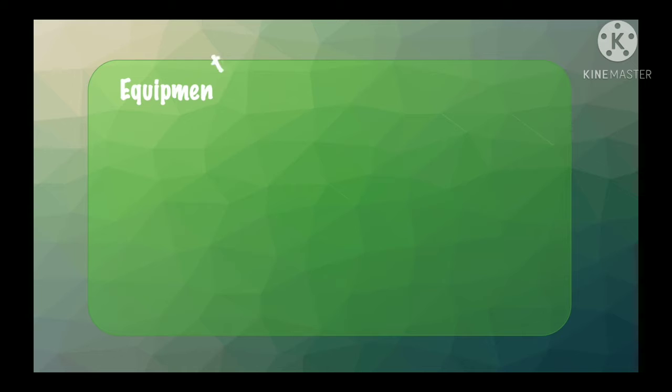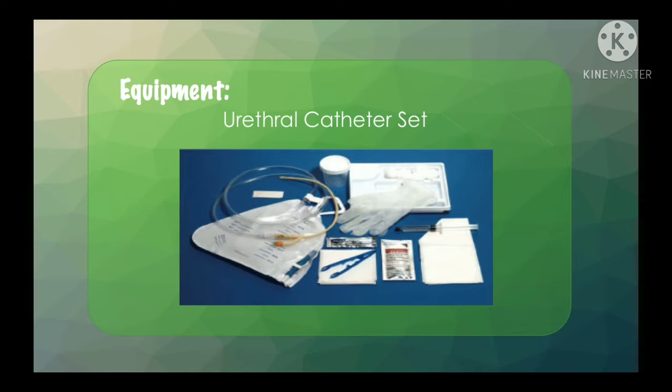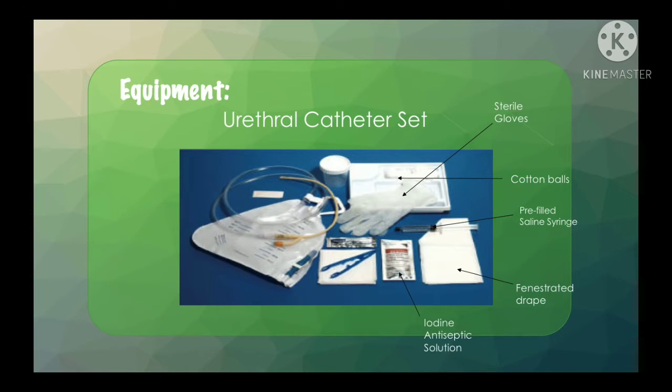Equipment needed for the insertion of Foley catheter. So, urethral catheter set. This includes sterile gloves, cotton balls, pre-filled saline syringe, fenestrated drape, iodine antiseptic solution, another drape, sterile forceps, lubricating jelly, collecting bag, Foley catheter with collection tube, and specimen container.